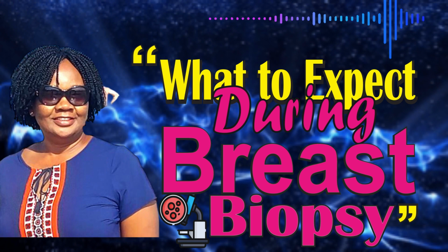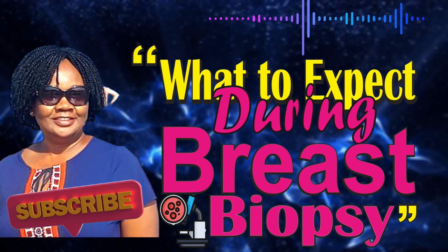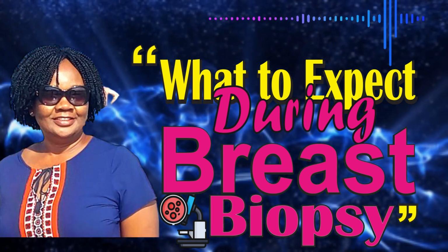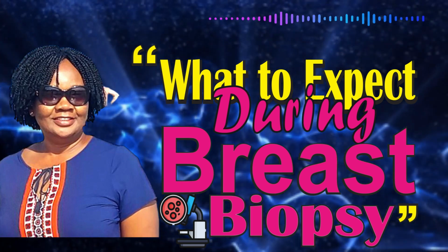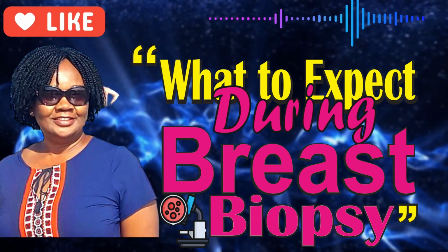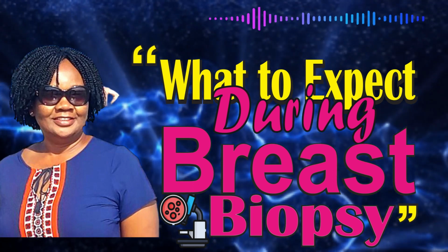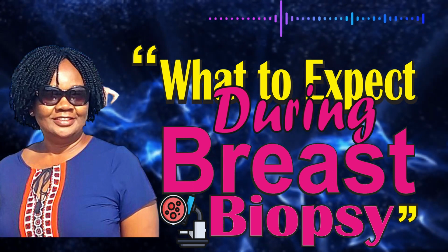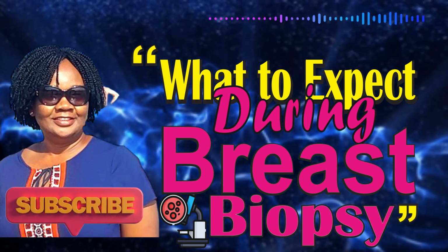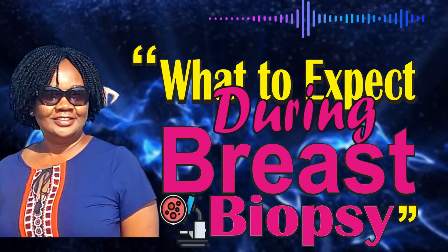I mentioned in an earlier episode titled Introduction to Biopsy that there are three main methods of taking tissue samples to be tested in the lab. 1. Ultrasound guided biopsy. 2. Stereotactic guided biopsy. And 3. MRI guided biopsy. Now, MRI has a whole different set of rules, so I will speak on that in another episode. Let's look at ultrasound guided biopsy.